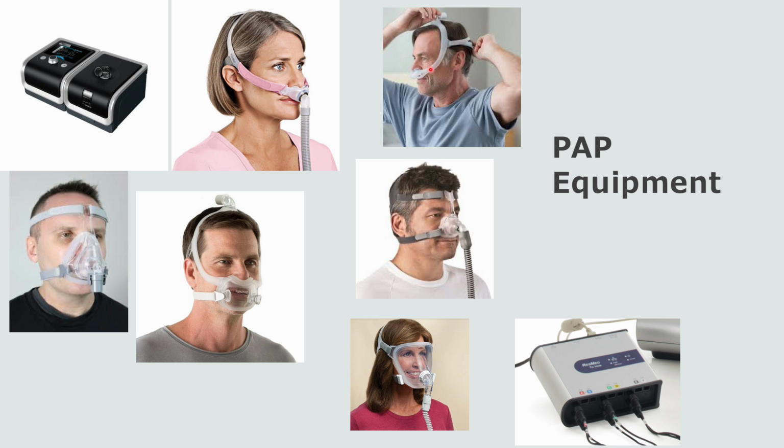Those are also nasal pillows. There's another nasal pillow, but instead of two pieces that stick out from the mask and into the nose, it's just a cushion, and it's just like a hole that sits against the nose. Next, we have the nasal mask right here, and that just covers the nose. I think that's a great starter mask, and I think this works better with patients who have deviated septums. There's something about pressurizing the environment around your nose instead of trying to pressurize both nostrils. You just don't get enough air in when you have that condition.